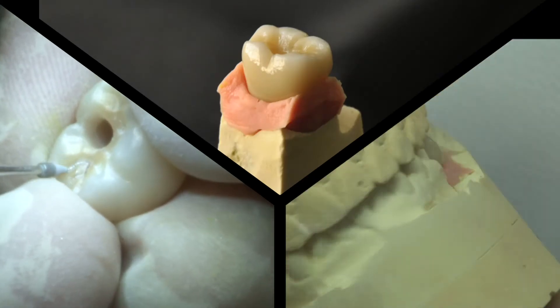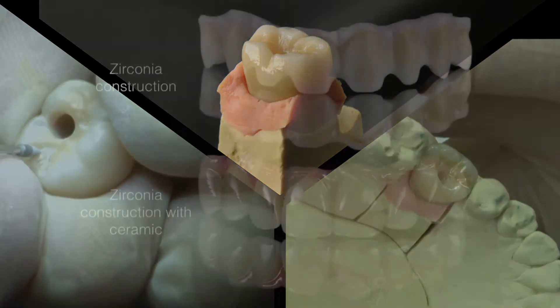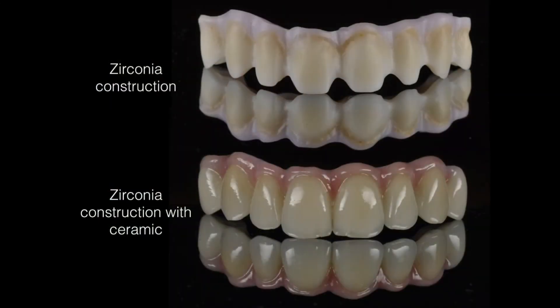Zirconia crowns and bridges are a popular type of all-ceramic restoration, which is worn to improve the appearance of a tooth which has become stained or disfigured over the years. They are durable, easy to wear and long lasting.